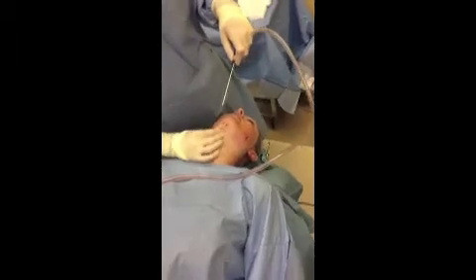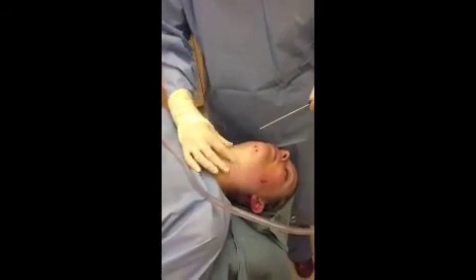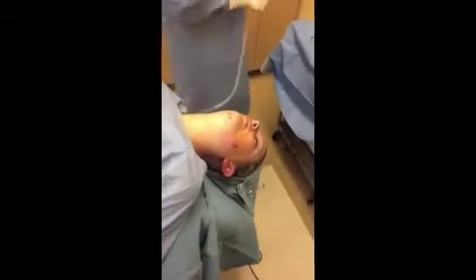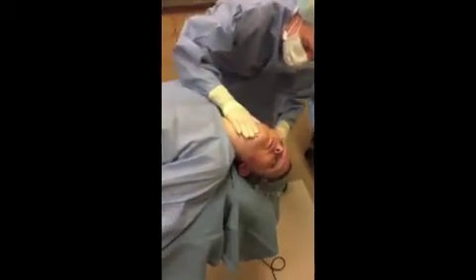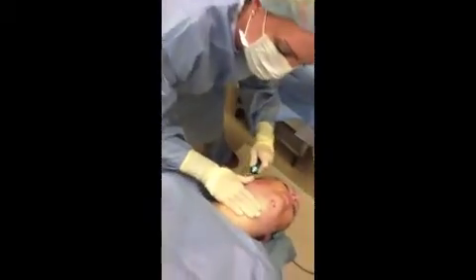So you can see when I did a pinch test now, where I was pinching over an inch, I'm now pinching just a teeny bit. I've got to get down a little bit down here. So I think I'll probably do from the foot over here. Turn it a little that way, Mary. There we go.